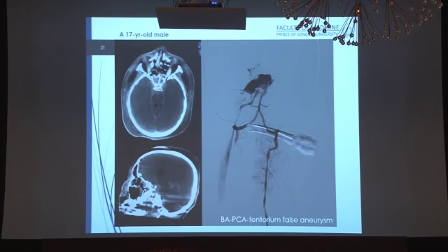Now let's see another example of a false aneurysm with active contrast extravasation at the basilar and PCA junction of a 17-year-old male who had a motorcycle accident with multiple organ injuries involving diaphragm, abdomen, and pelvis. This patient died after uncontrollable deterioration in the angiogram room.